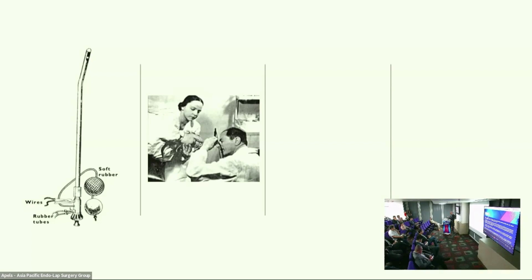Nasilip mo na ba? Because that's the way they were exposed to, no? Instead of nasilip mo na ba? The action that we now use is nasilip mo na ba? But before, nasilip mo na kasi the exposure then, before the flexible endoscope, is that way. They're using a rigid scope.